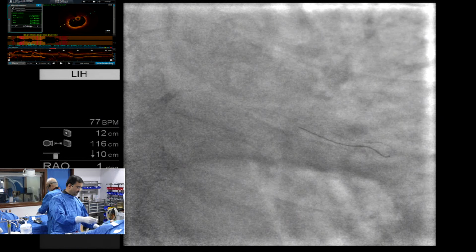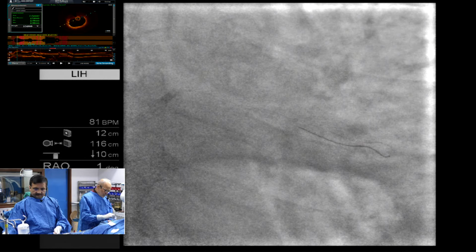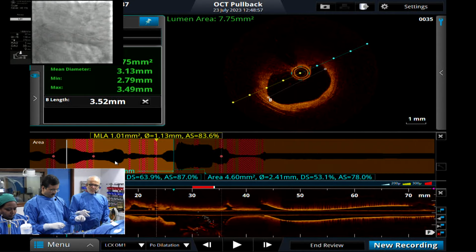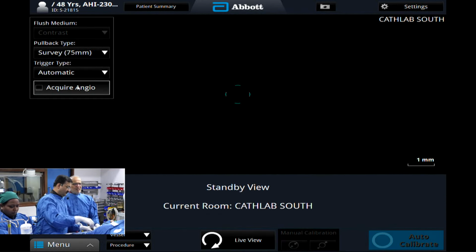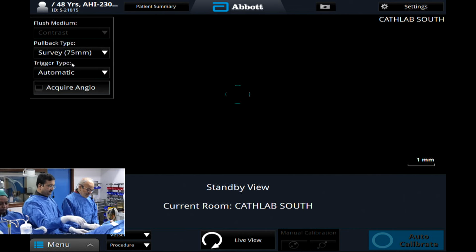I too. Normally I post dilate and then look at more optimization need, but here I'm not sure the proximal landing zone is forgiving. So let us do OCT imaging, because we want to measure exactly the malapposition in certain regions, and of course underexpansion in the proximal area if at all. I personally feel that there is no underexpansion.